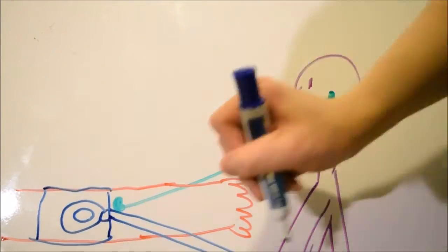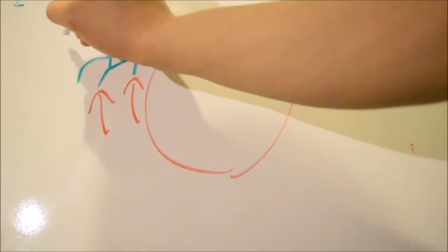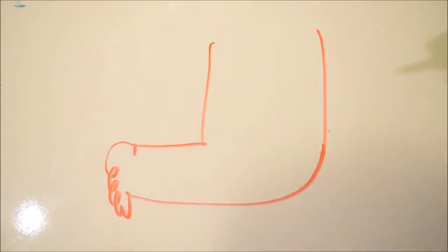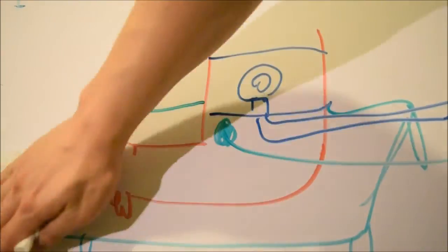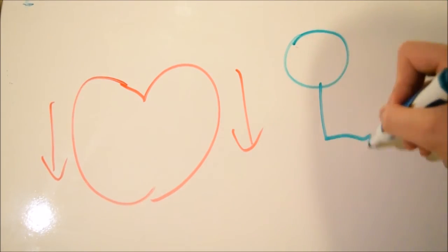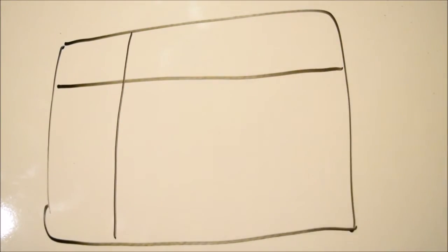For the next exercise, we need to elevate the subject's heart rate to a moderate level, so take off the equipment and begin either jogging on the spot or even doing mountain climbers. We now need to get the subject seated as quickly as possible, then place the cuff over the brachial artery once again with the stethoscope and begin the recording session. If the experiment continues for an extended period of time, the subject can perform exercises to elevate their heart rate once again. After the data collection has been finished, we should compile the data.